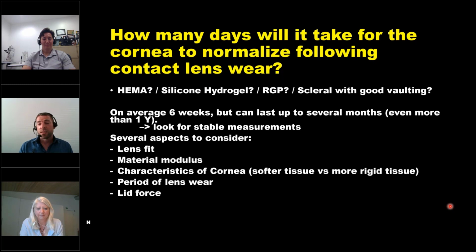It can even end up changing over a course of several months and even up to a year. So there is no distinct answer. In my opinion, measure until you have the same measurement twice, and then you know you're back at baseline, or should be back at baseline. That's my opinion on this. I don't know, Mette, if you have anything else.